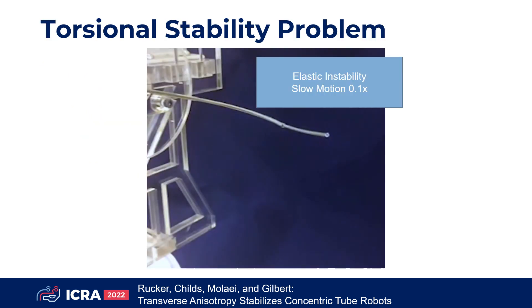This video illustrates the stability problem. For certain designs and configurations, the robot rapidly transitions, or snaps, to a new configuration.